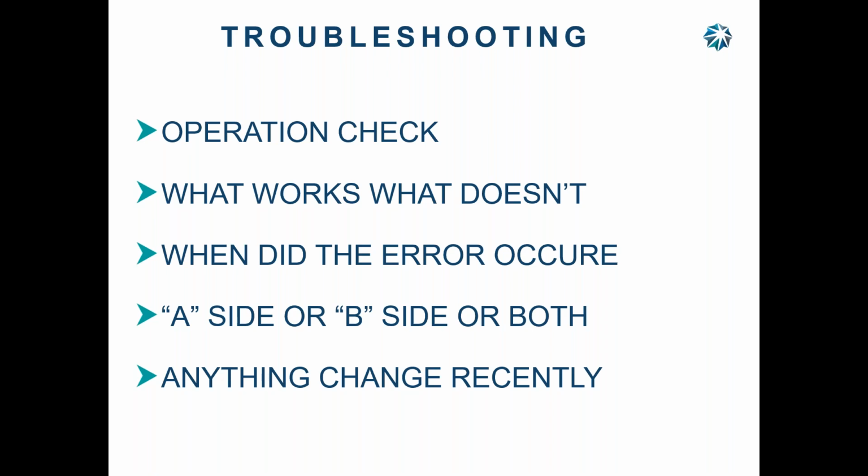So when they went above 6.5, they got an overpressure and it shut it down. Nothing like saving money that doesn't work, right? Use what you're supposed to use. It said right there, max flow rate, 6.5. They did a 7.5 injection, did not work.